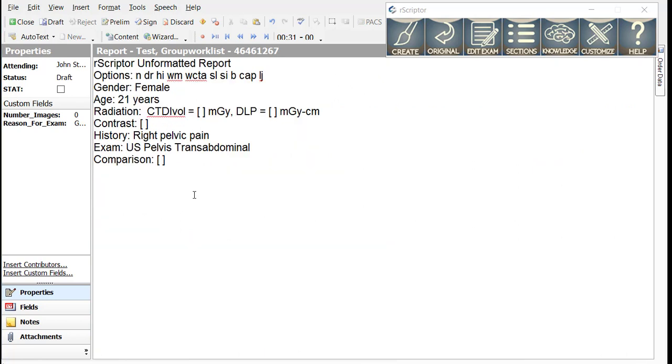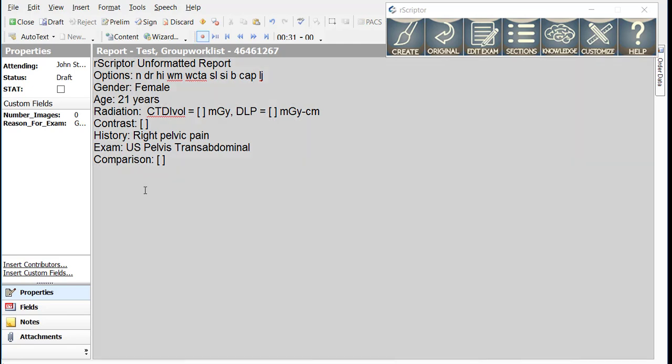This is a transabdominal pelvic ultrasound. The smart macros in this case are used to insert dimensions of the uterus and ovaries as follows. Uterus 5.4, 3.6, 4.1, 0.8.